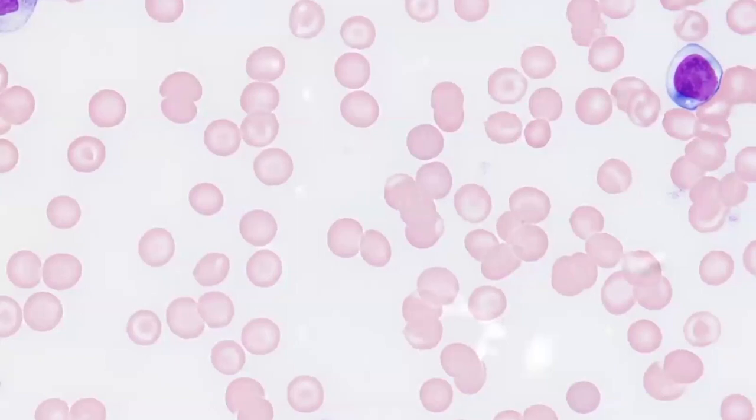This may be caused by more membrane than normal due to excess lipid deposition, as seen in liver disease, as in this case, or less than normal loss of lipid during maturation of red cells, as seen in post-splenectomy states, or by decreased or abnormal hemoglobin content, as seen in thalassemias and hemoglobinopathies. When the target-shaped red cells are microcytic, consider thalassemia and hemoglobinopathy at the top of your differential. However, when the red cells are macrocytic, this is generally associated with liver disease.